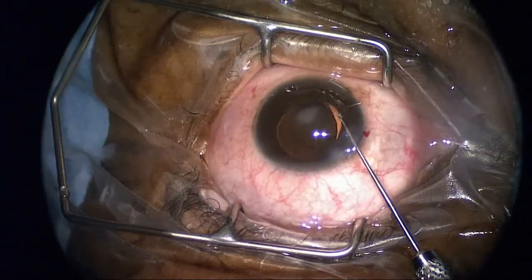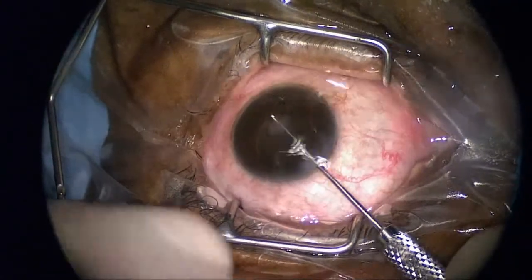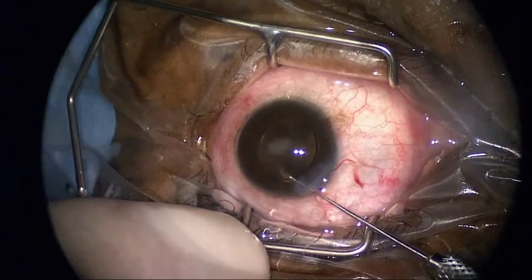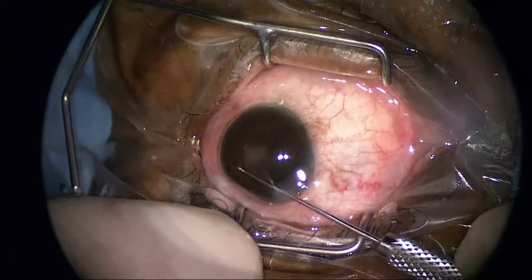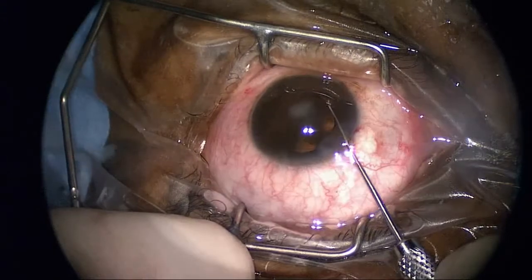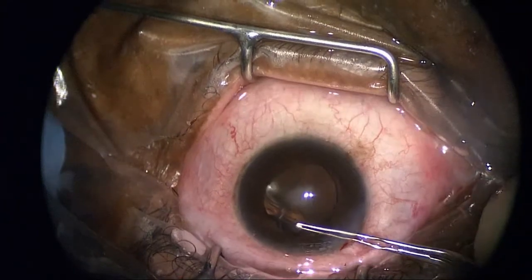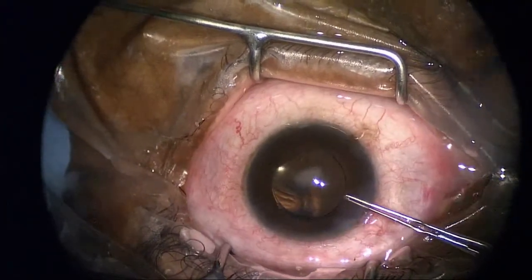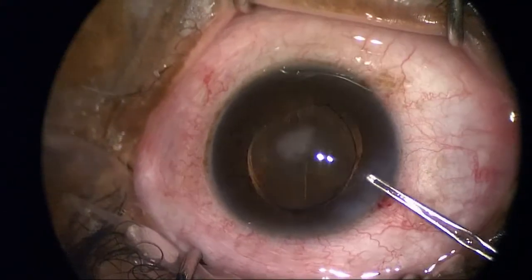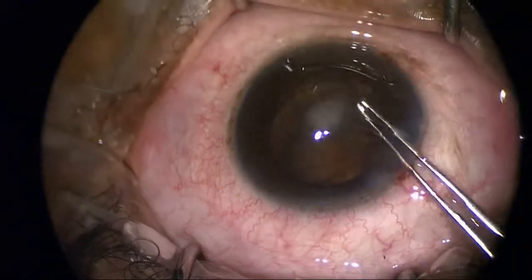You can see I'm using the nucleus manipulator here to reposition the intraocular lens, and I immediately go to scoring the Descemet's membrane in preparation for removing the posterior collagenous layer, Descemet's, and abnormal endothelium. I'll go ahead and do a descemetorhexis — tearing the tissue — with the Carlson DSEK forceps, creating a nice margin from the abnormal endothelium.